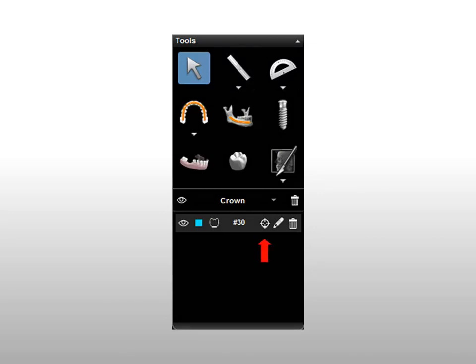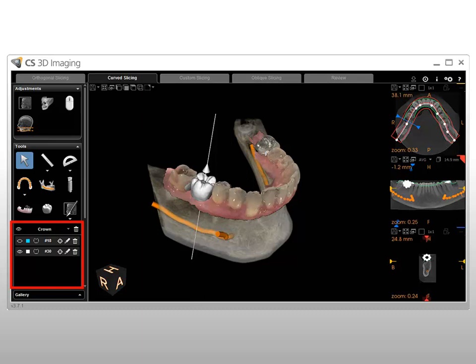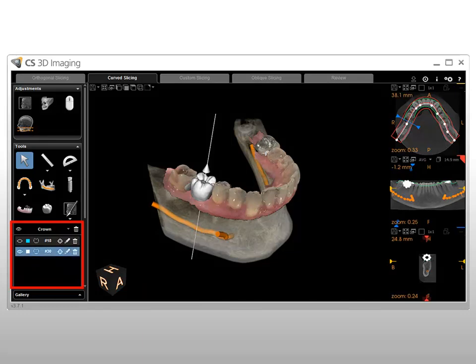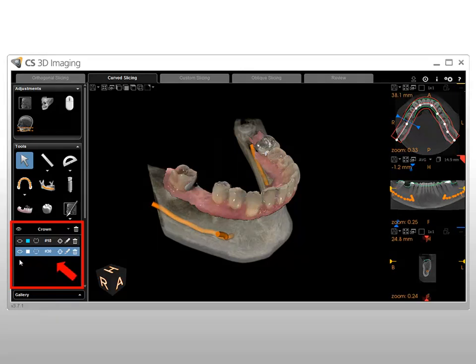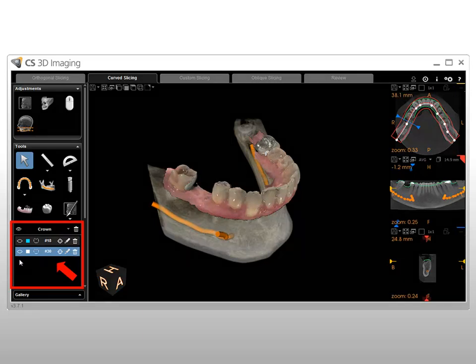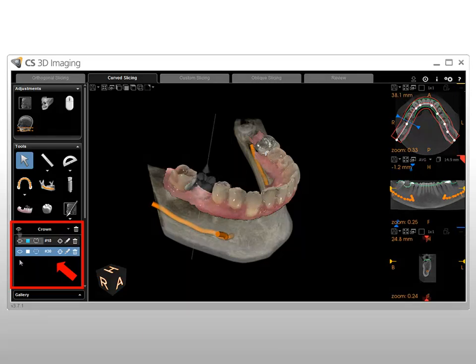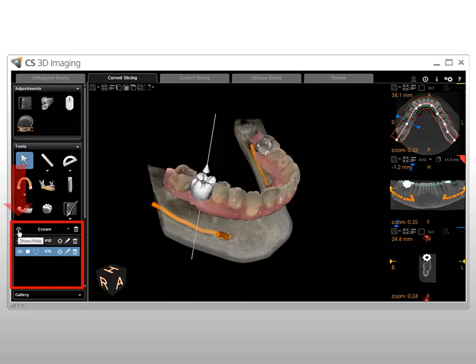Click the Bullseye button to automatically center all view screens on a selected crown. To show or hide an individual crown, in the Crowns section of the Object Management panel, select an individual crown, then click the open eye to hide it or the closed eye to show it. To show or hide all crowns in the volume, click the eye repeatedly.